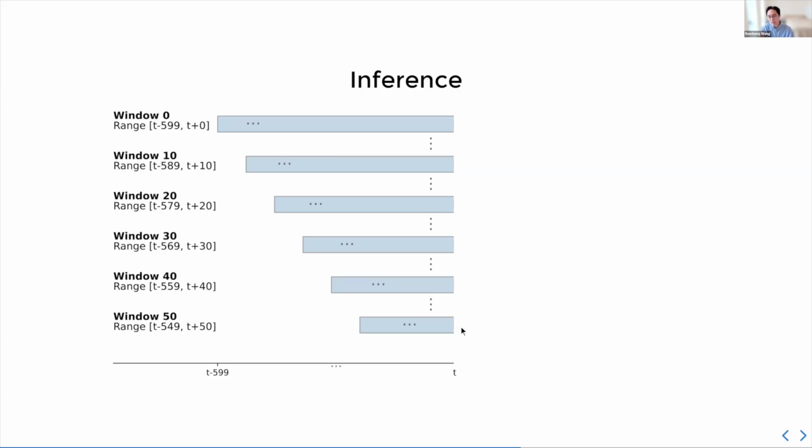This is the first time you're seeing the opening signal. It's probably very difficult to predict this open, because one time step of EMG, as I said earlier, doesn't really give you a lot. It will be helpful to look at the EMG that comes after t to make sure that it is open but not noise. And since EMG captures everything, even if you wave your arm or try to open while you're moving your arm, it will be captured. So we have to reject noise, and we have to be stable.